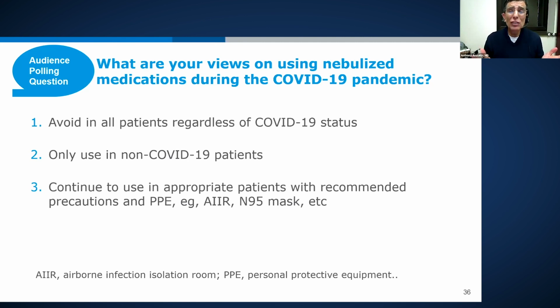So that's what we said, this doesn't make any sense. We have a closed ICU, we have a closed environment. We're going to go back and use our nebulized delivery systems for our patients on the ventilator. And then we start seeing a significant difference. We start seeing a significant decrease of mucus plugs, which was described at the beginning. We were using nebulization, humidification in our ventilator circuits. And all that has significant impact on patient care.